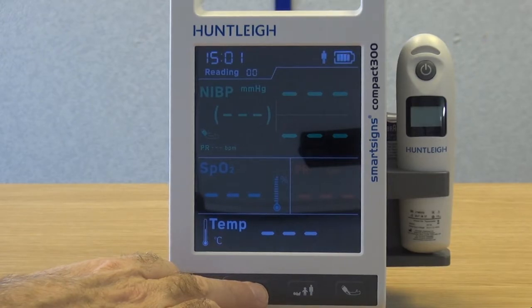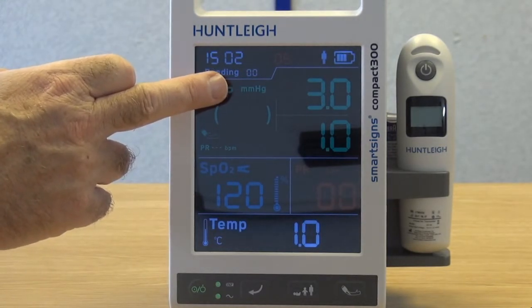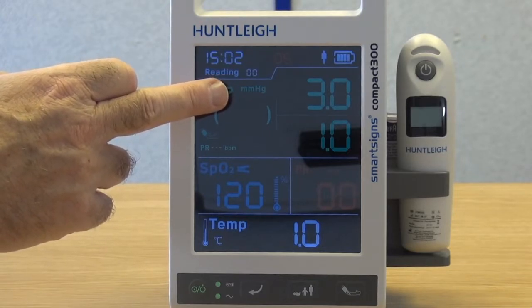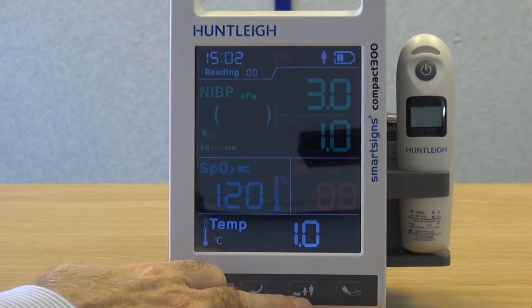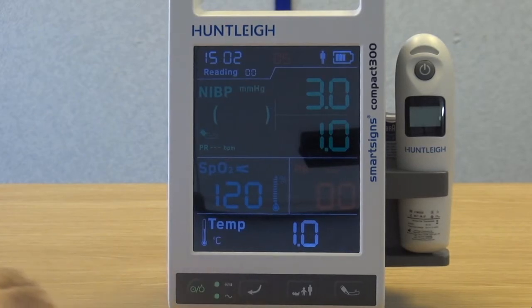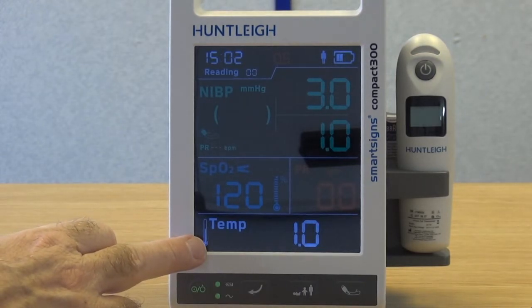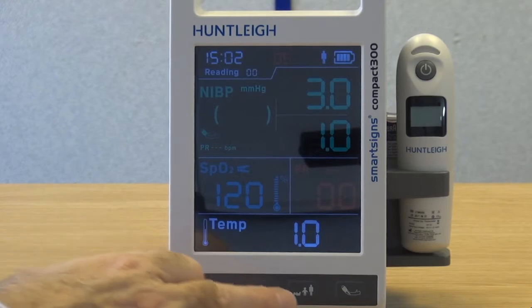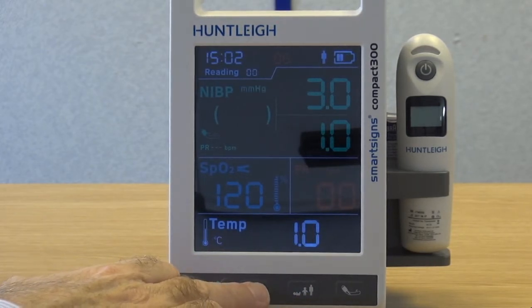When the firmware screen is displayed, press the return key to advance through the setup options. The unit of measure area will flash — depending on the setup, this will either be millimetres of mercury or kilopascals. Use the patient group button to select the desired setting. Press the return key to advance to the next setup option. The temperature unit will flash — depending on the setup, this will be either degrees centigrade or degrees Fahrenheit. Use the patient group button to select the desired setting, then press the return key to advance.